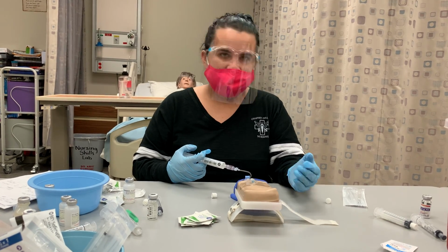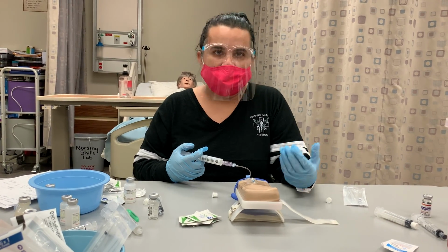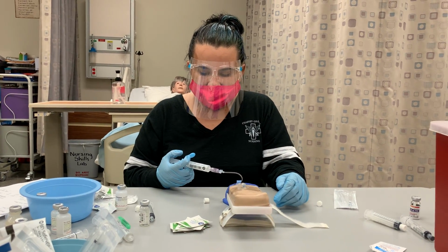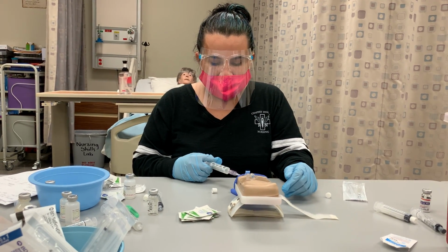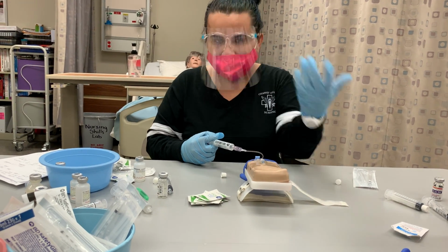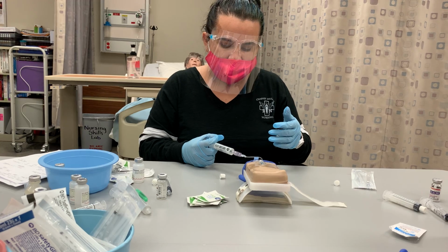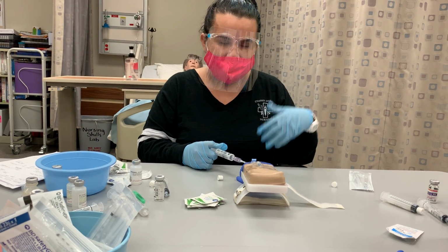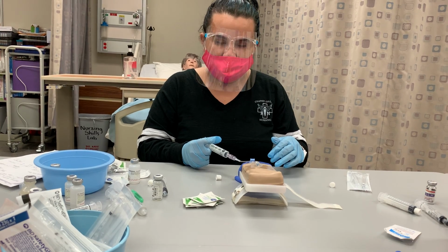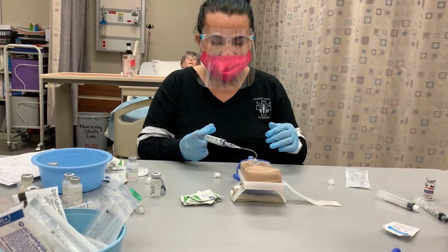And again, keep assessing the patient, keep talking to the patient, assessing any concerns, questions they might have, or anything that we need to speak about. So again, for educational purposes only, we would be done with pushing the medication that's diluted with normal saline.